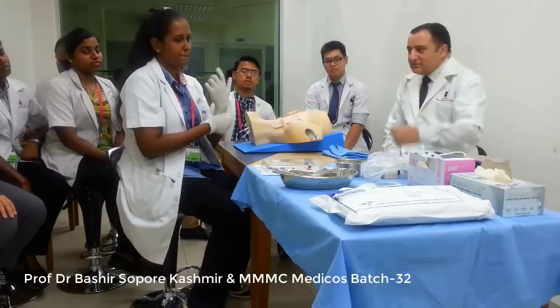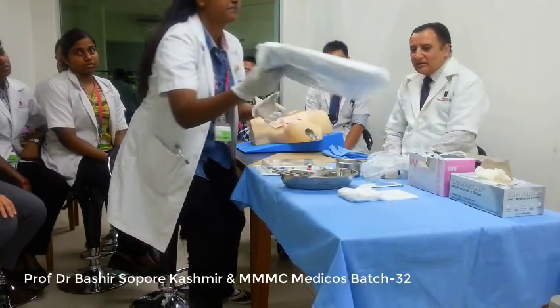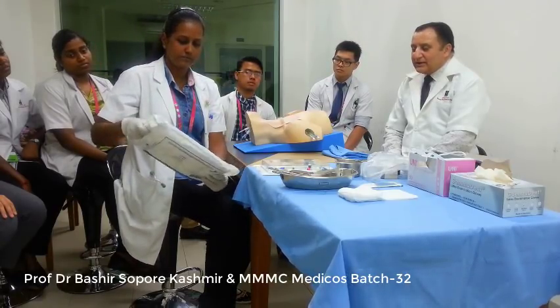What will you do next? You will take the sterile gown, and you will wear the sterile gown.